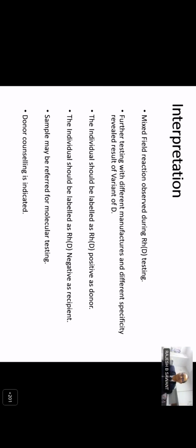The third question is regarding patients where we use massive blood transfusions intra-op. Generally, after 5 or 6 units of transfusion, the blood bank asks for a repeat sample for cross-matching.